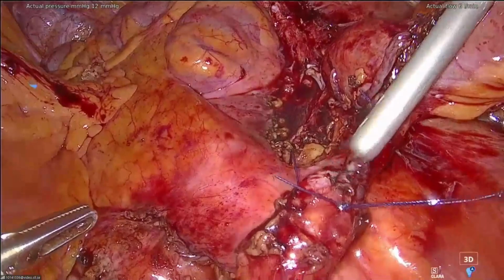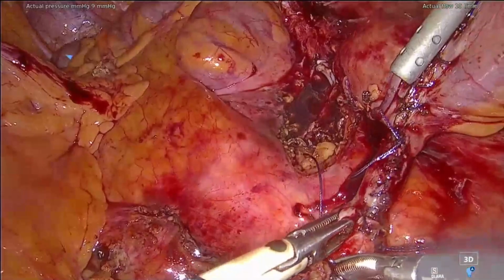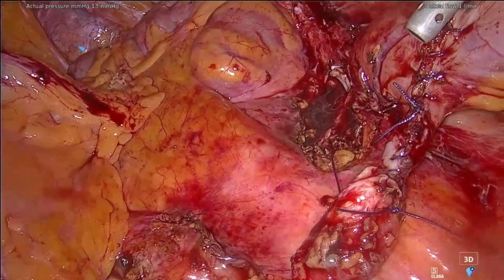Yeah. I have a small leak here, I think. Yes, just between the sutures. Okay. The question is if I put one more stitch or if I just leave it like that and leave the drain. No, it's okay. Give me a suture of the same. I will just put a stitch here, but just one, because better is the enemy of good enough. And the best option is probably just to wait.